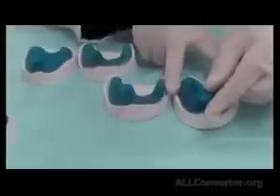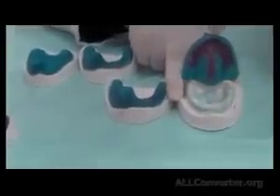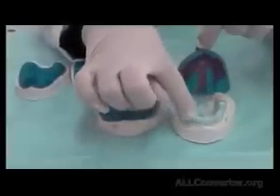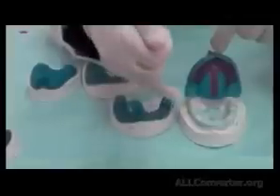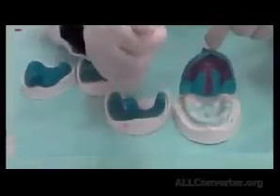What we are doing is what we call the selective pressure technique, meaning that I fabricate the tray in a way that I place the spacer only over those areas that need relief. And we have discussed those areas: the mid-palatine raphe, the rugae area, the crest of the ridges. If I have undercut areas with thin mucosa over them, these should be relieved.